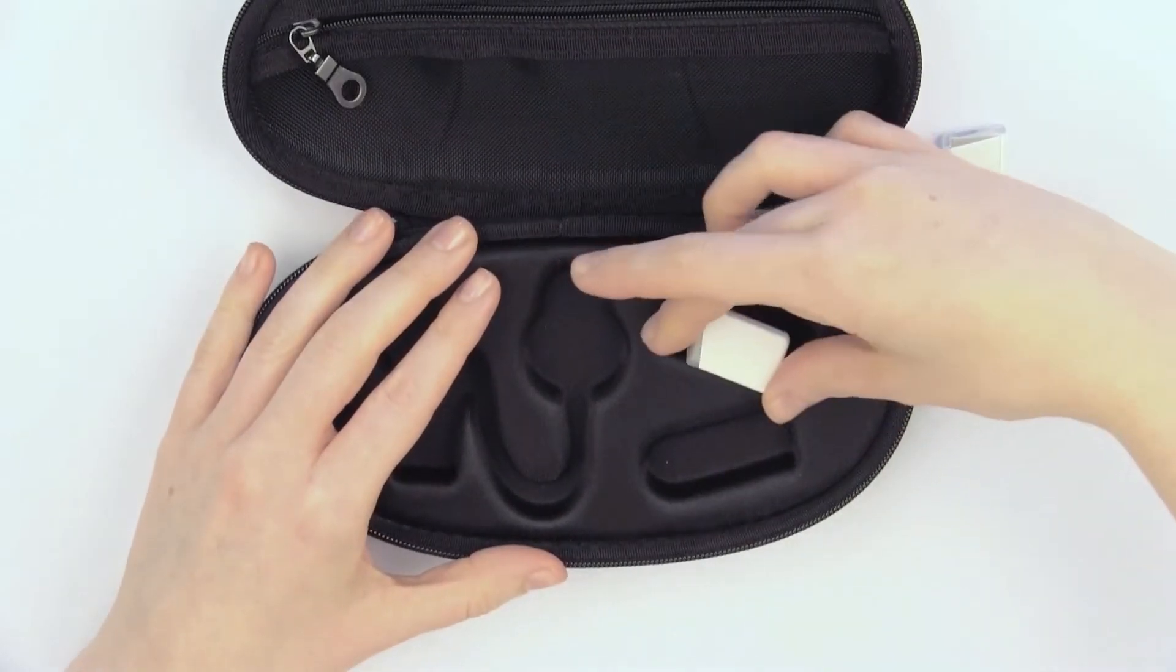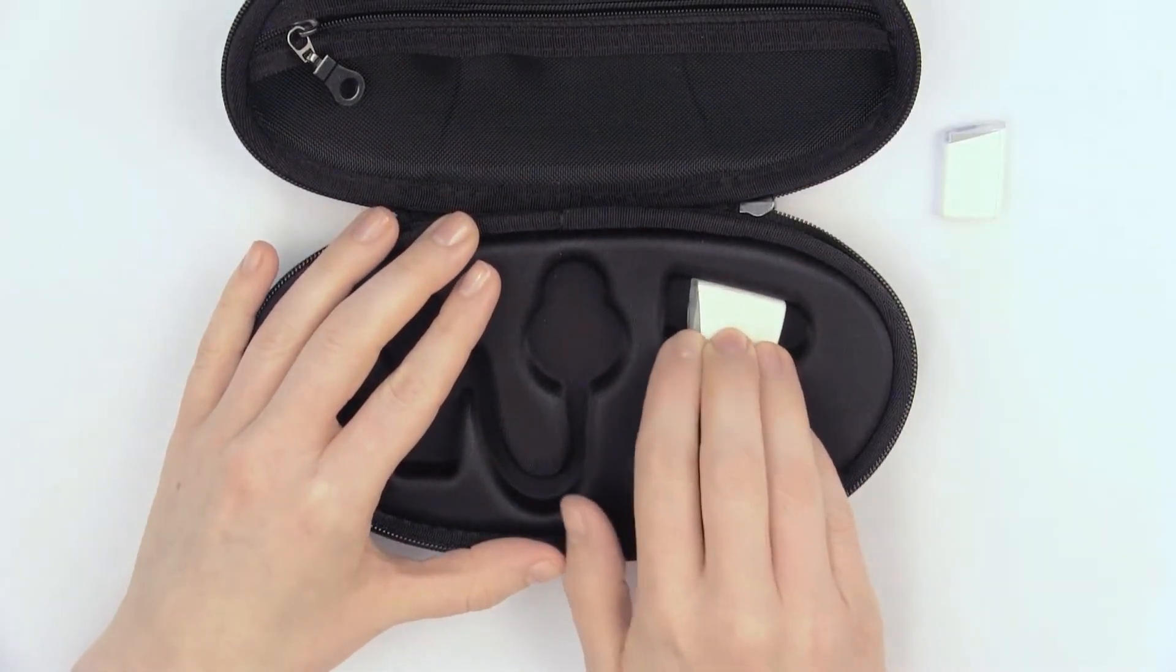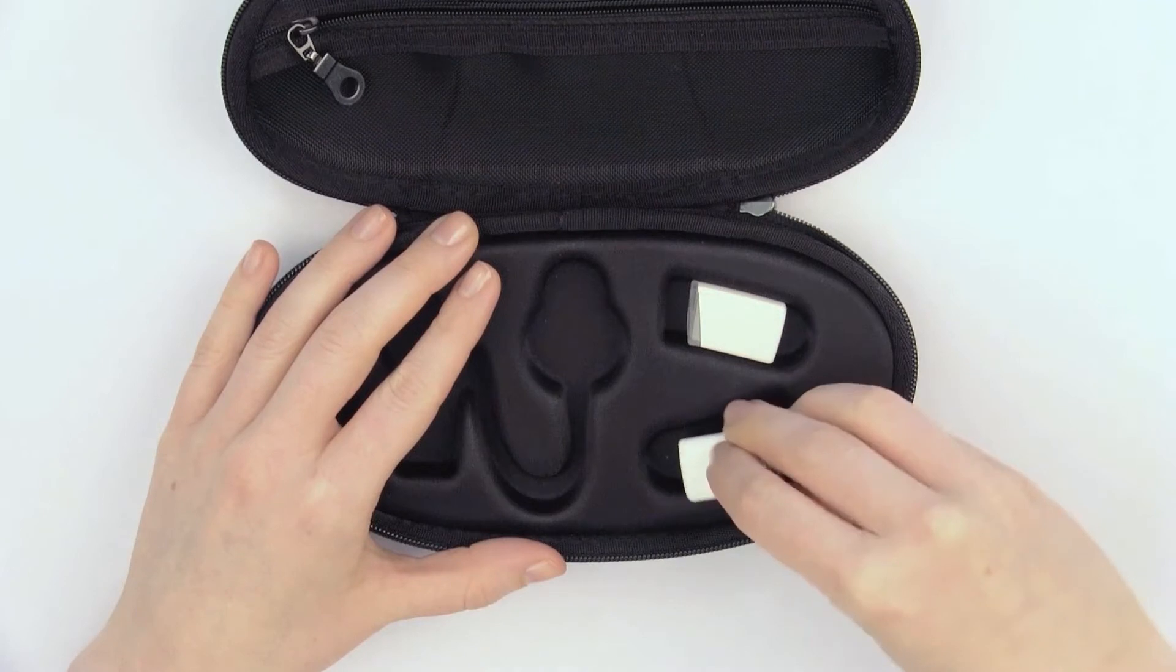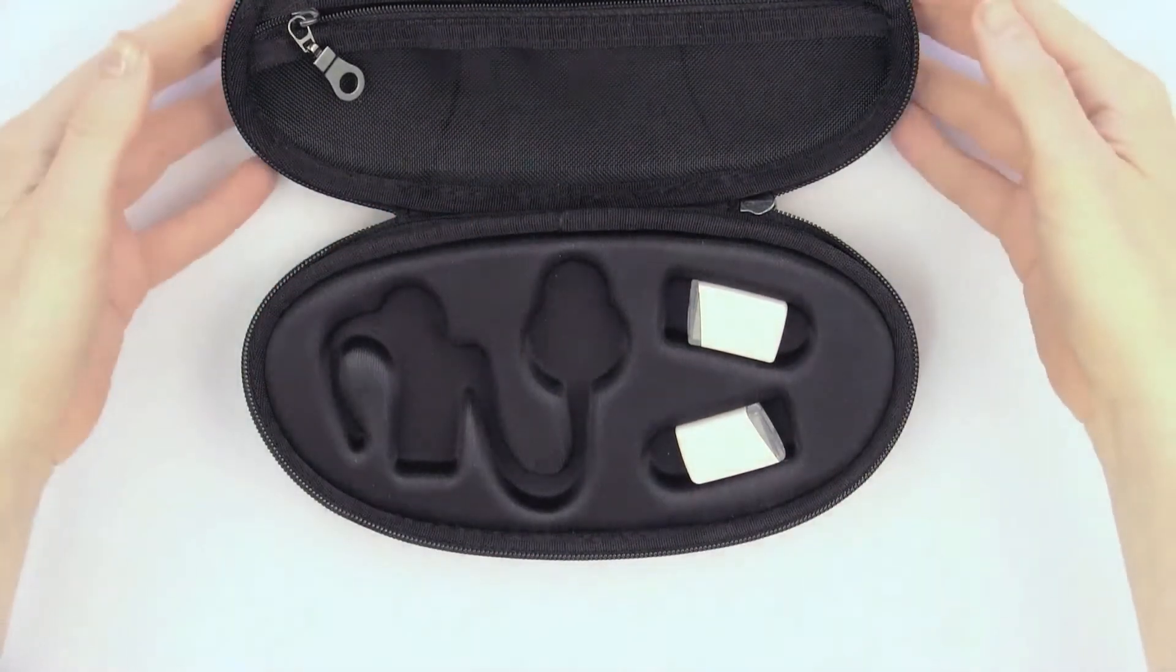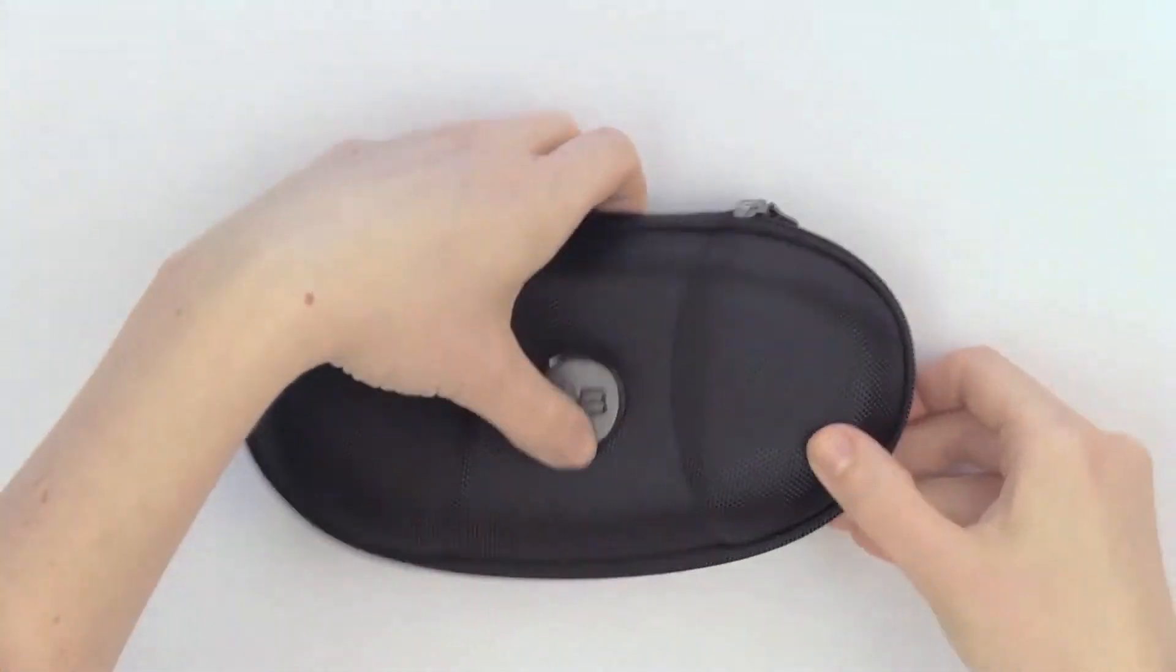Batteries should not be loosely carried in pockets or handbags, as this may cause debris to accumulate on the connector. The carrying case included in the Naida CI kit can also be used for transporting batteries.